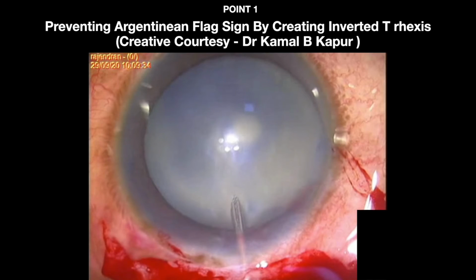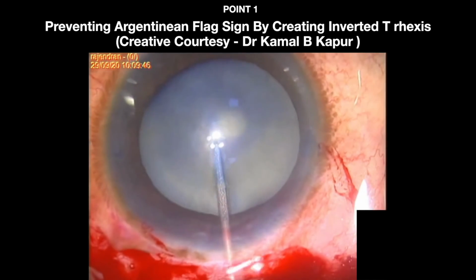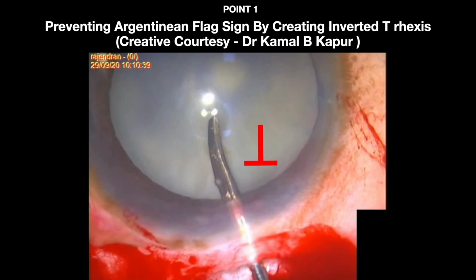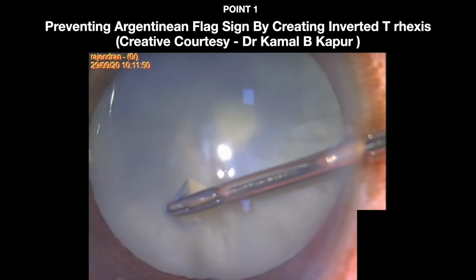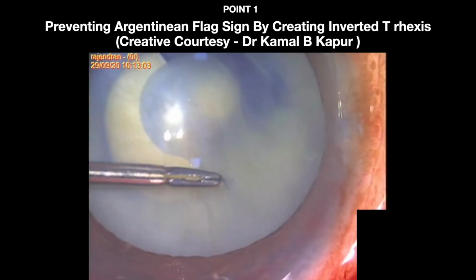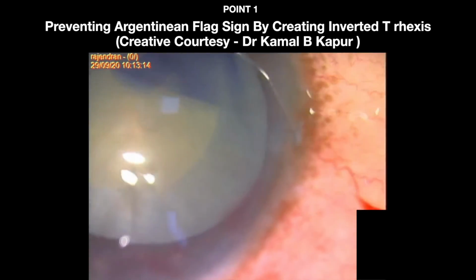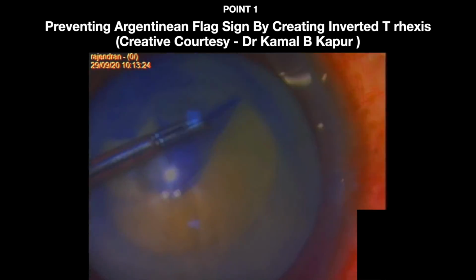Point 1. Preventing Argentinian flag sign by creating an inverted T-rhexis. The intralenticular pressure of an intumescent cataract can be reduced by injecting a 26 gauge needle faced bevel down and performing a graded suction with a glass syringe. The idea then is to perform two hemicircular rhexes with two flaps, one from the clockwise direction and the other from anti-clockwise direction. So, in scenarios where one flap extends to the equator, there is always another flap present for achieving and completing the circular rhexis.